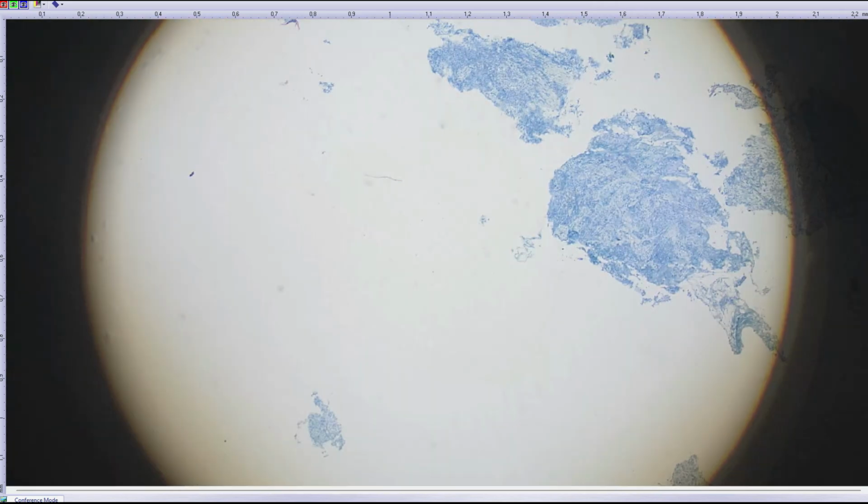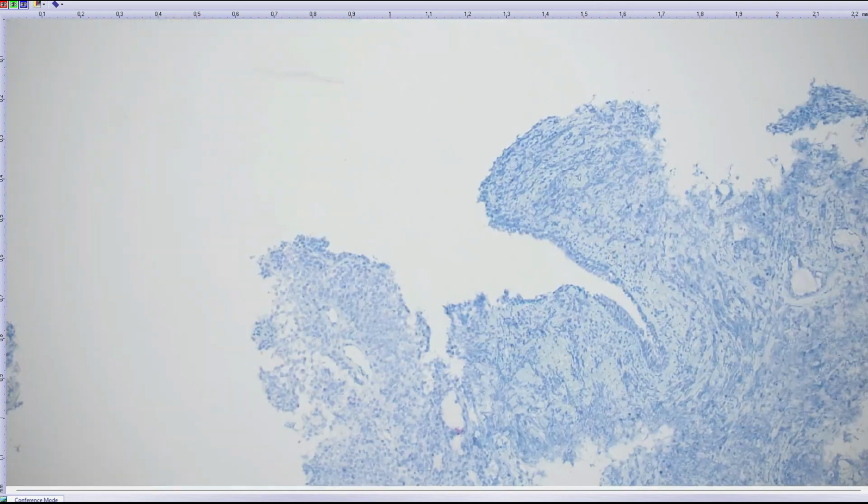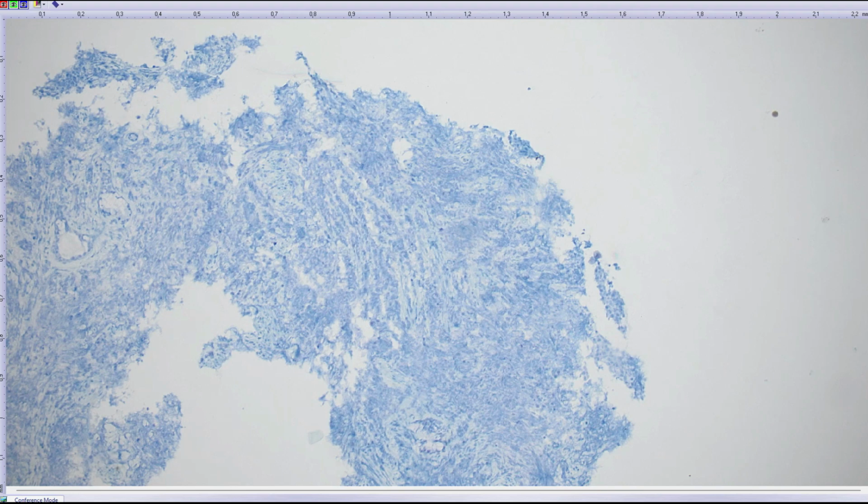One more perhaps useful thing is that we have RAS and BRAF antibodies, which can detect the most common BRAF and RAS mutations in melanoma. Unfortunately, the RAS immunostaining was negative in this case, because the specific NRAS mutation in the tumor, Q61K, is not covered by the antibody. About a quarter of NRAS mutations are this specific one. So in these cases, the RAS antibody will be negative.